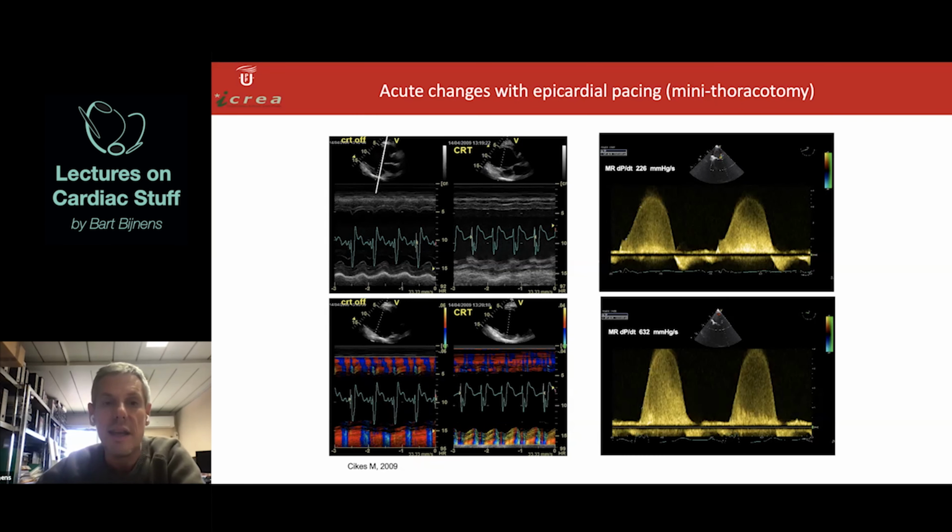And this is a patient with a dilated cardiomyopathy and heart failure, in this case because of an arrhythmia, because of a dyssynchrony and left bundle branch block. So what we see here, looking at this profile, is that this is going up very, very slowly. That means that the pressure buildup is very slow, very inefficient.